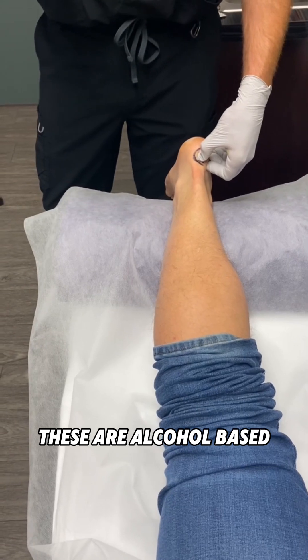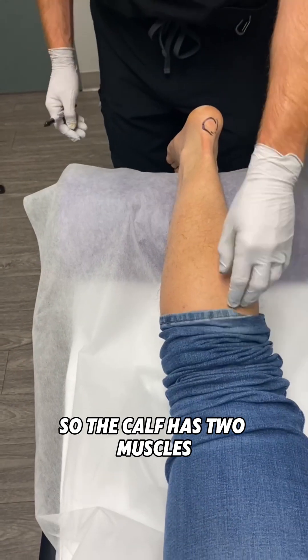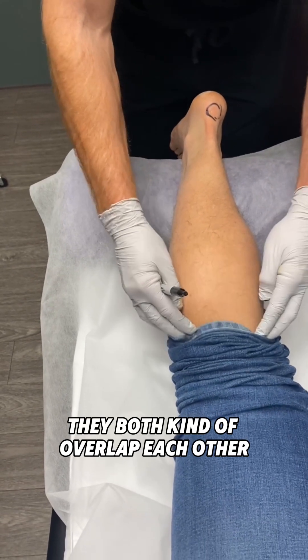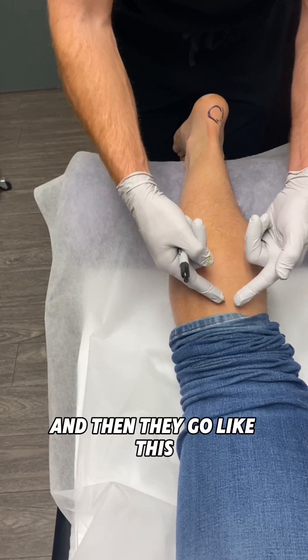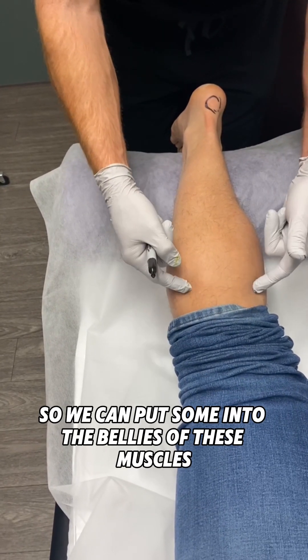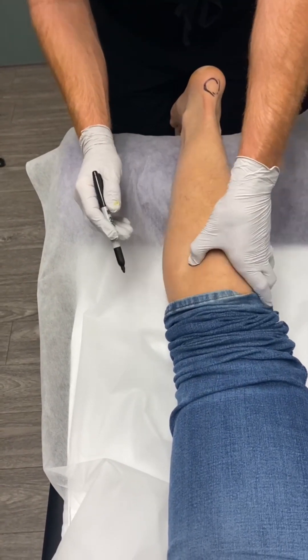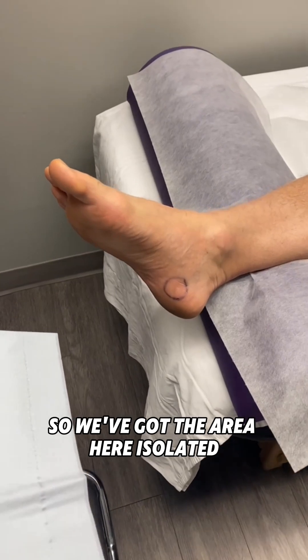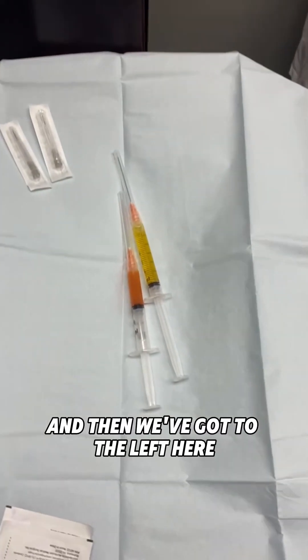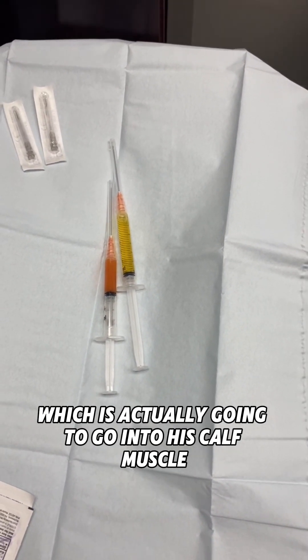These are alcohol-based so the risk of infection is low. The calf has two muscles; they both kind of overlap each other. We can put some into the bellies of these muscles. So we've got the injection area isolated — to the left is the platelet-rich, and then the platelet-poor, which is actually going to go into his calf muscle.